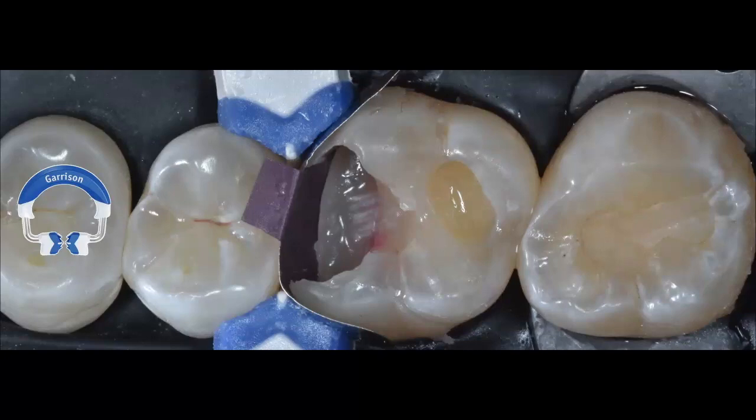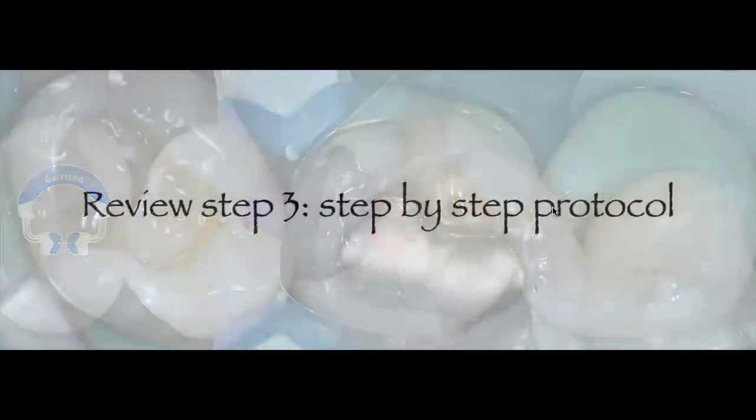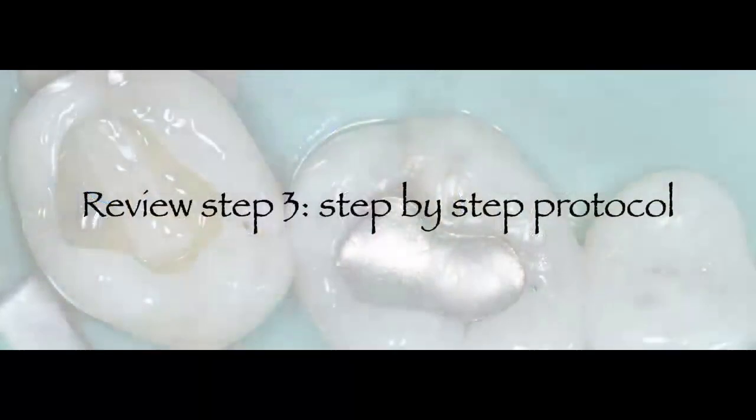and reestablish a nice interproximal contact. But as you can see, the prongs have an area of composite where they have positive seating, so that this is not affecting the shape of that sectional matrix. And that's what's crucial here. I've also elevated the margin, and I'll show you that when I go through the step protocol of this case. But now I'm ready to restore that proximal wall, and if I restore that proximal wall, I'm ready to establish a nice interproximal contact.